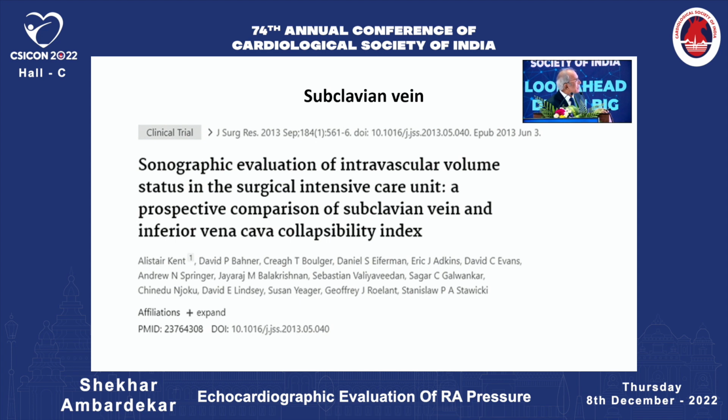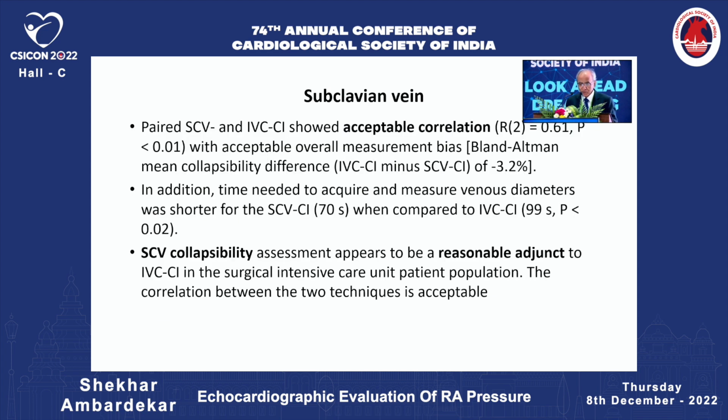Look at the subclavian vein. This particular paper studied sonographic evaluation of intravascular volume status with the subclavian vein, and compared it with IVC collapse. And what did they find? That the correlation is quite good. It is an acceptable correlation between subclavian vein collapse and IVC collapse. They also found that this method may sometimes be quicker, maybe even faster. Their numbers were 70 seconds versus 99 seconds for the IVC. So it is a reasonable adjunct, but of course this does not replace looking at the IVC.